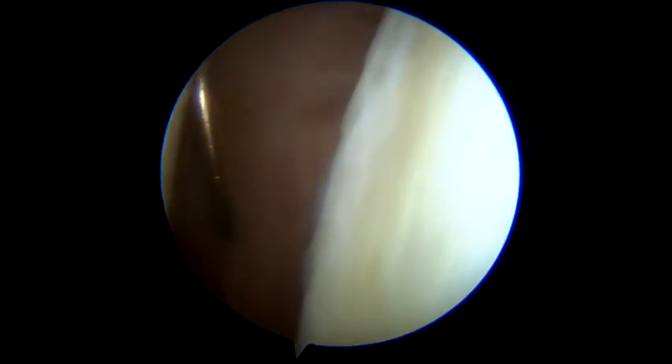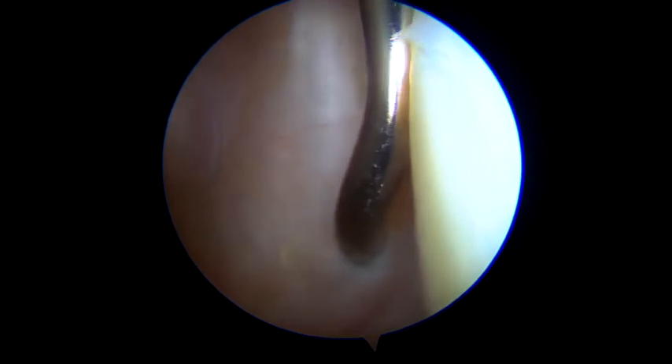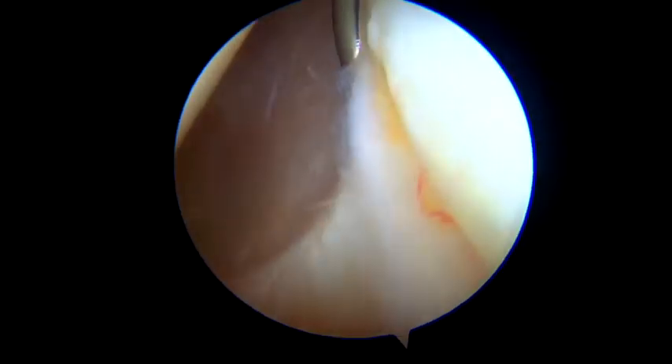During the exploration, if an eventual labral lesion has to be found, it must be repaired using a classical anchor technique. The procedure is initiated using a clave hook, which is passed at a 5 o'clock position to the capsular tissue in a length of approximately 1 to 2 cm.